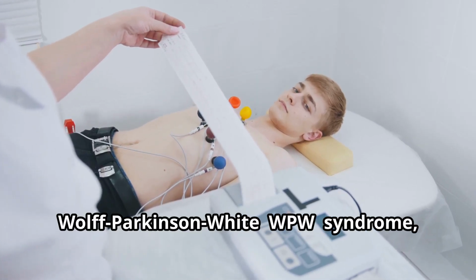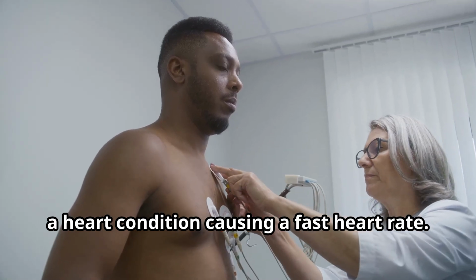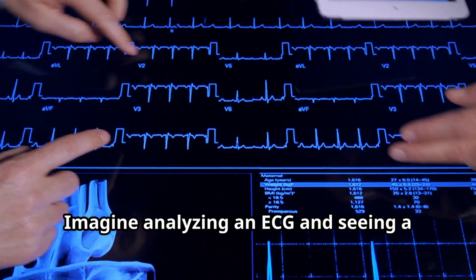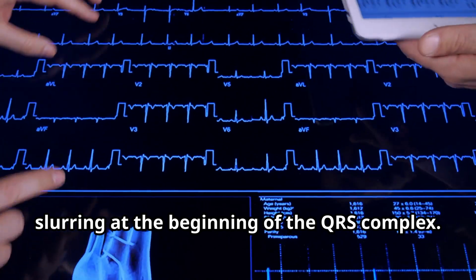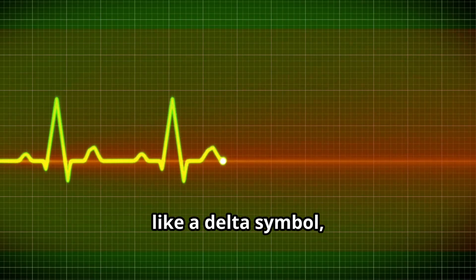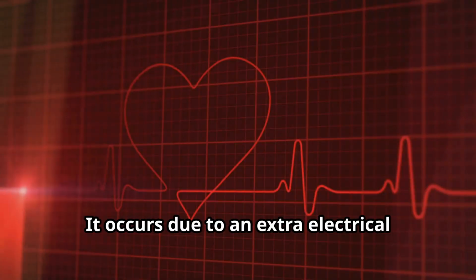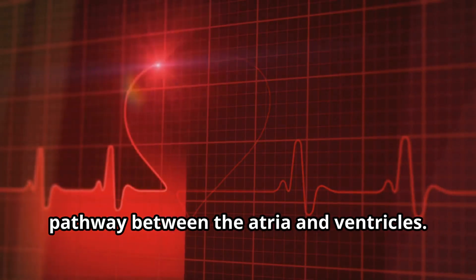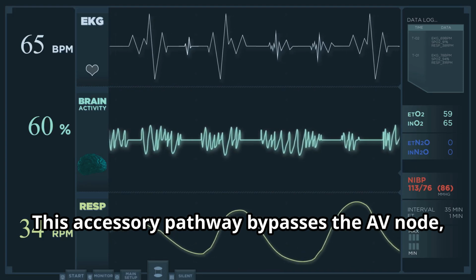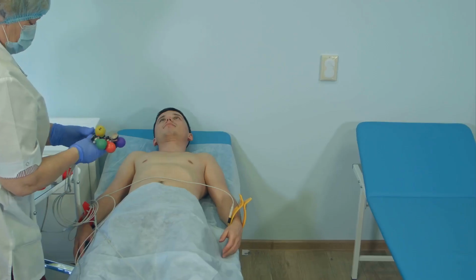Let's unravel the mystery of Wolff-Parkinson-White (WPW) syndrome, a heart condition causing a fast heart rate. Imagine analyzing an ECG and seeing a slurring at the beginning of the QRS complex. This small wave, like a delta symbol, is the hallmark of WPW syndrome. It occurs due to an extra electrical pathway between the atria and ventricles. This accessory pathway bypasses the AV node, leading to pre-excitation and the delta wave.